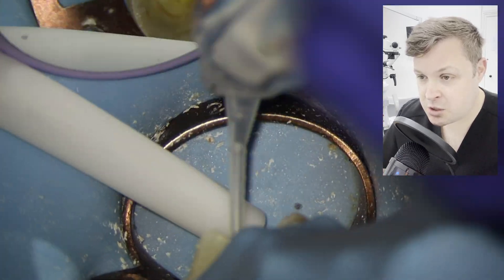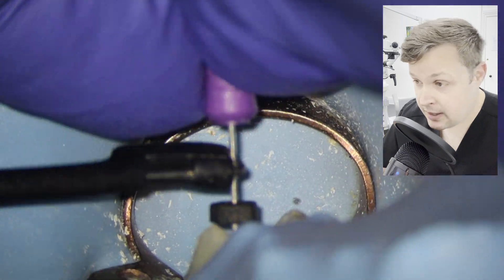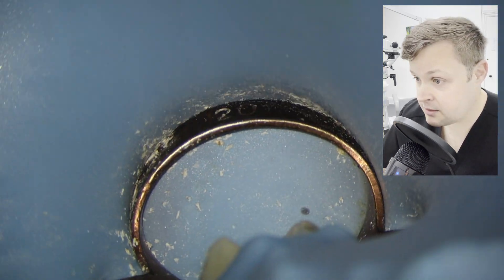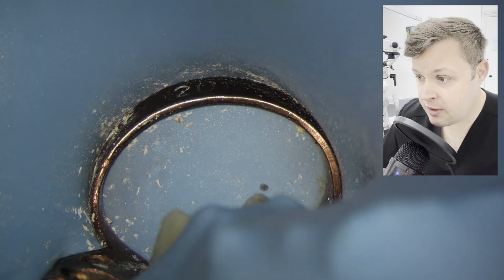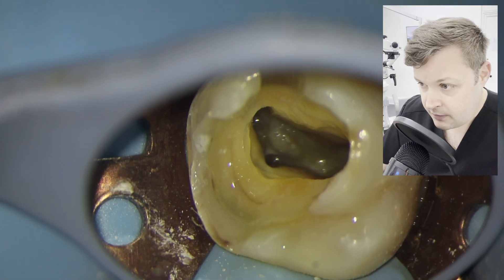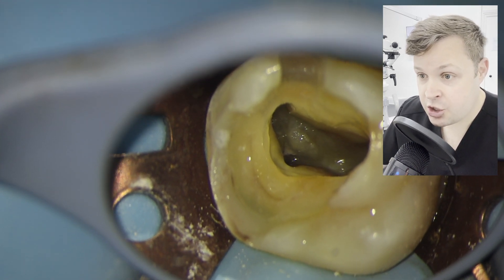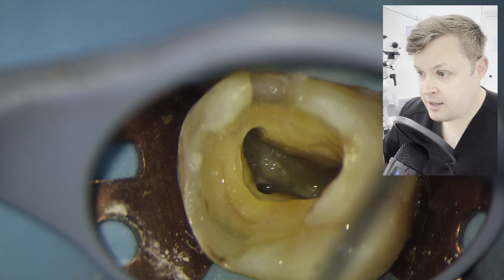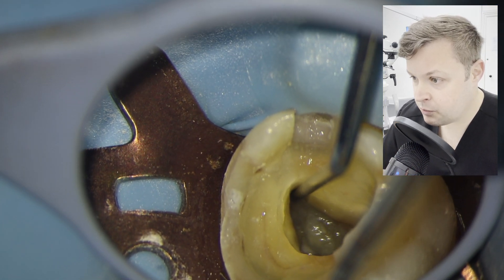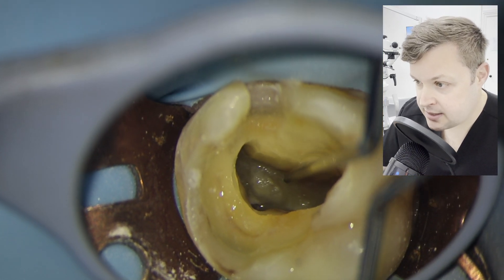I've just sped up my shaping protocol here. I'm using size 10K files, 2% sodium hypochlorite and HyFlex files. It's a given now that these canals have been shaped. You always shape the first three before you go for the MB2. We've got the DB, the MB, and now the palatal.